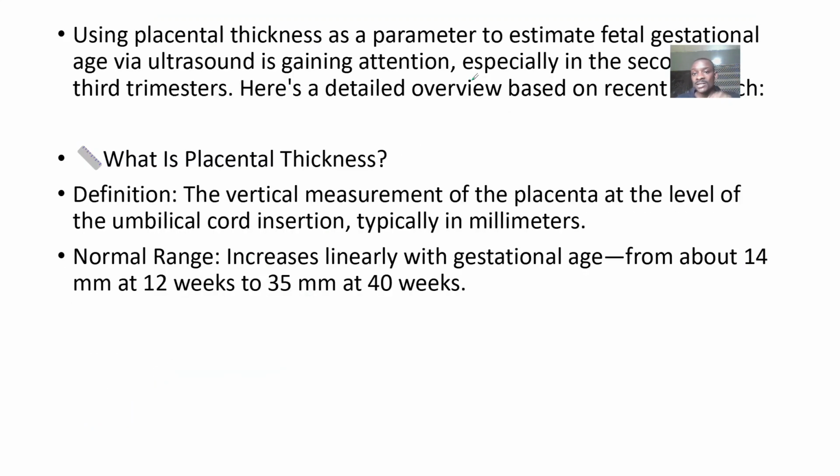So it's a parameter used to estimate fetal gestational age, right? All right, via ultrasound. So it's actually gaining attention. That's what I mean, so I'm even talking about it. It can be used to actually determine it, especially in the second and or third trimester.